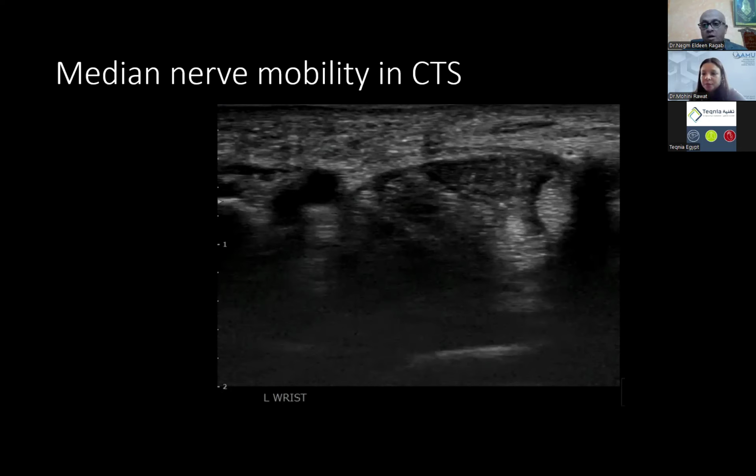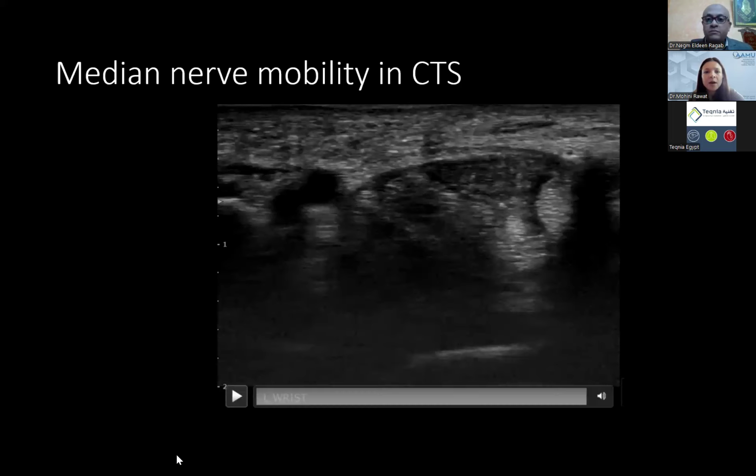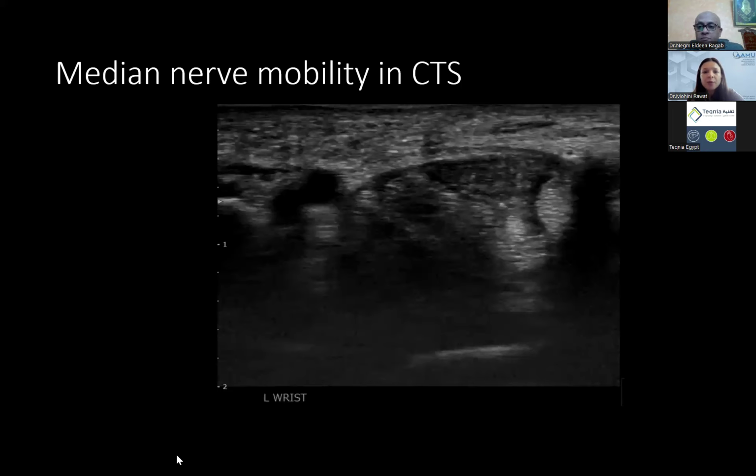We have another question. The question is, how often can ultrasound be used for nerve injury? And what about the temporal course of abnormalities seen during nerve trauma?